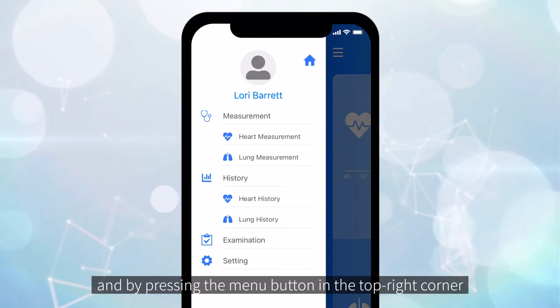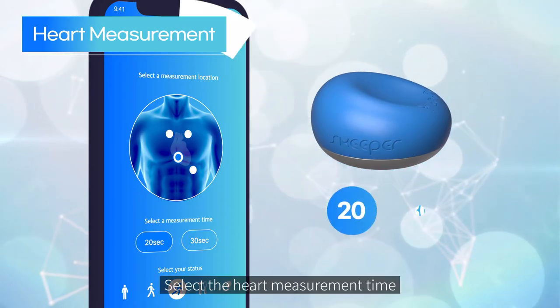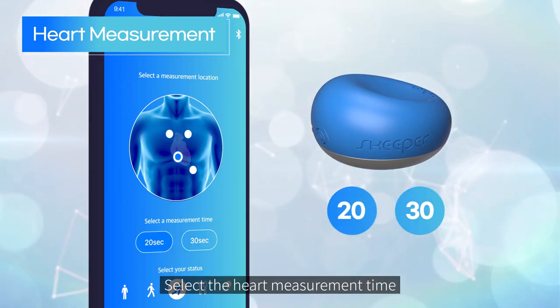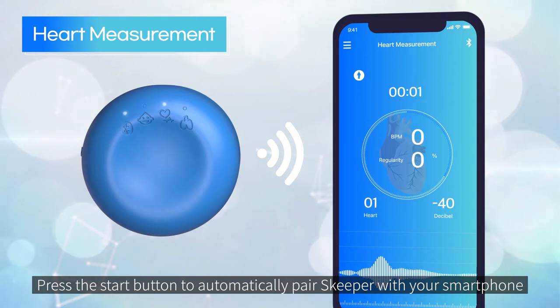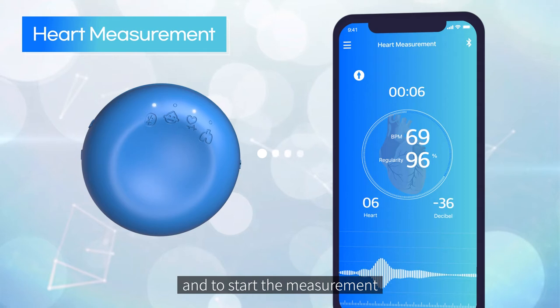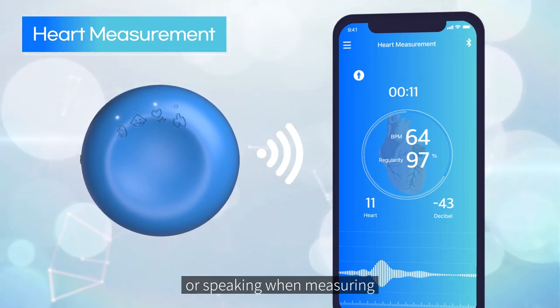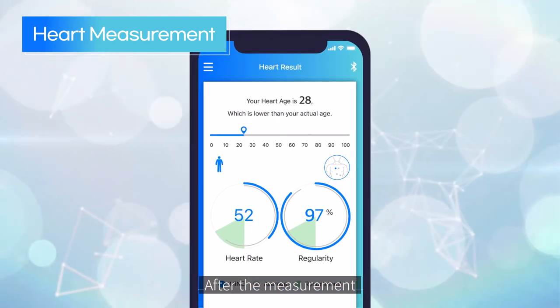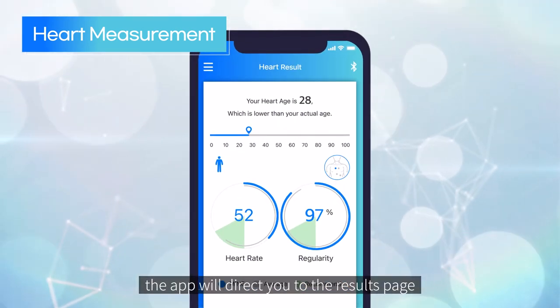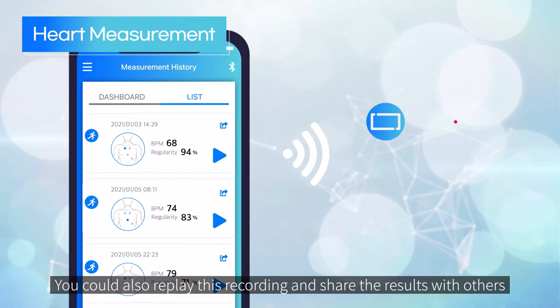The app's main screen shows the most recent measurement — heart and lung. By pressing the menu button in the top right corner, you can access further information. For heart measurement, select the heart measurement time and press the start button to automatically pair Skipper with your smartphone and to start the measurement. We recommend that you sit in a comfortable position without moving or speaking when measuring.